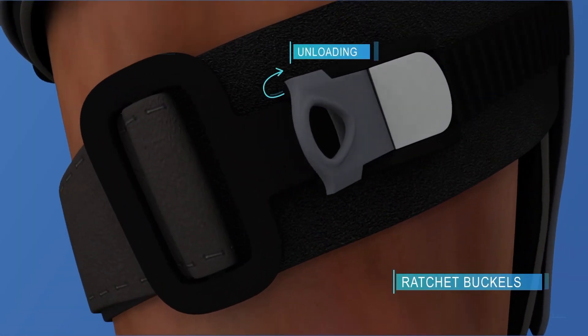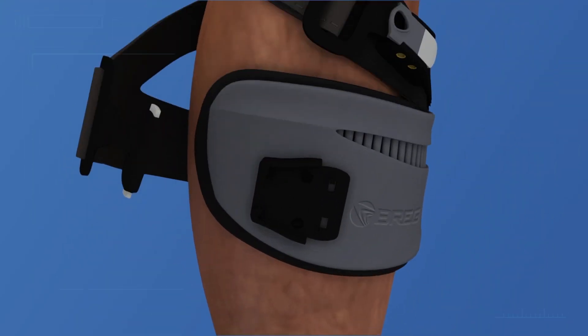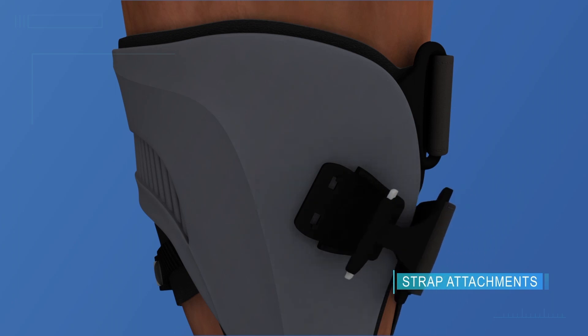Patients are able to manage pain by adjusting the user-friendly ratchet buckle feature. Quantum's quick and easy strap attachments make it effortless to apply and remove.